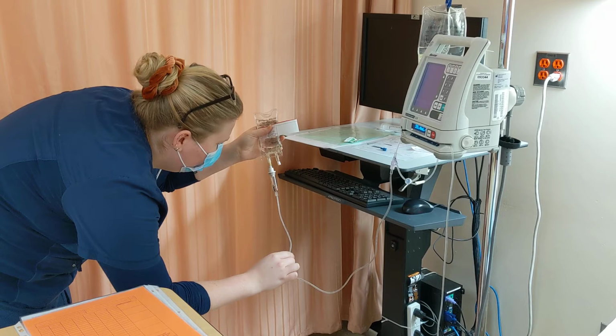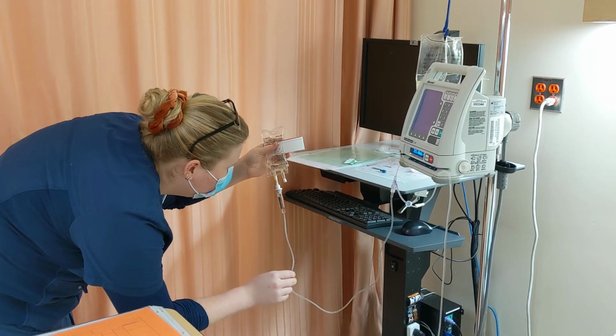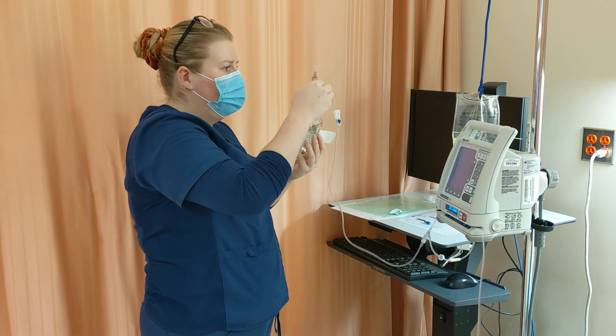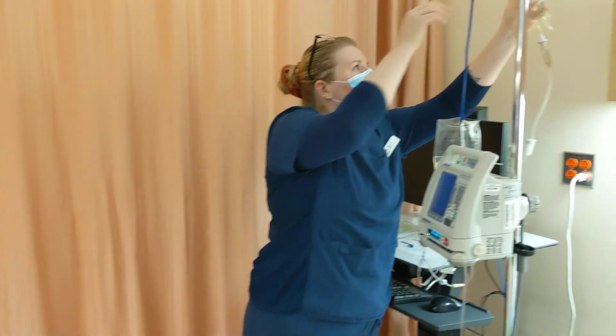There we go. Once we get it going there, we make sure all the bubbles are out. All the bubbles are out. I'm going to make sure that this is only half full. So that's good. I'll make sure this is open, and I'm going to hang this.